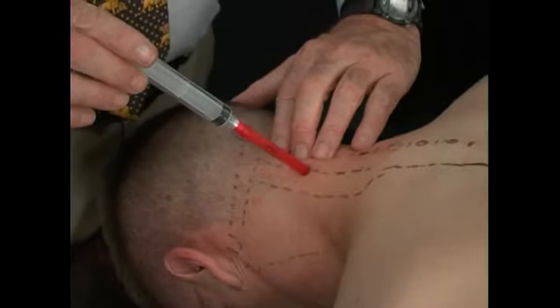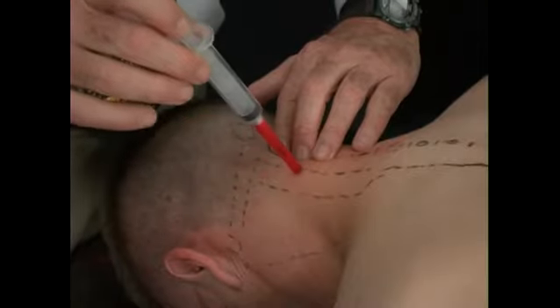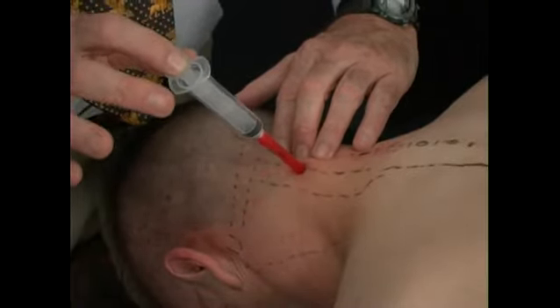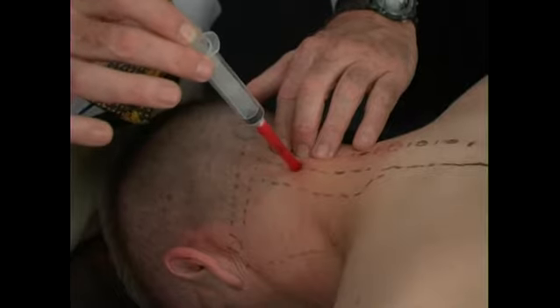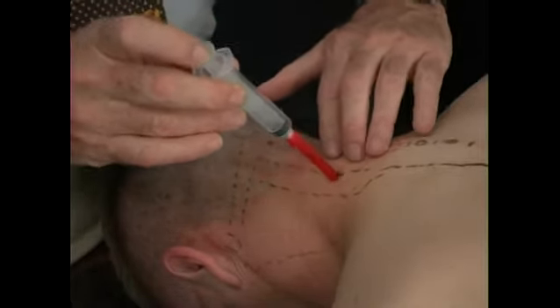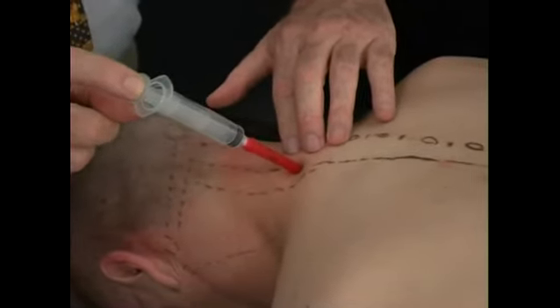You may maintain a little bit of caudal direction, or you may just inject straight in with, again, a little bit of medial orientation, 20 or 30 degrees off of the midline. This is perpendicular. This is about 30 degrees in toward the midline. We just walk down then with multiple injections, usually 4 or 5 injections, in a row down this area.